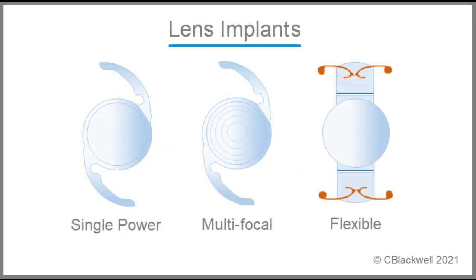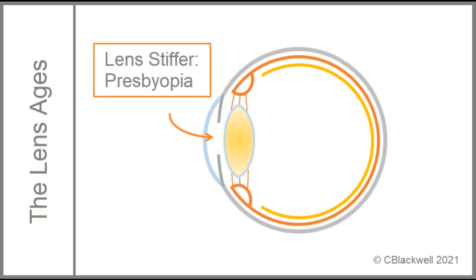While lens implants are not perfect, the results are pretty good and continually improving. They have reached the point where lens replacement surgery is becoming an option for treatment of presbyopia. It is the same as with cataract surgery, except that you're not replacing a cloudy lens. Rather, the purpose of this surgery is to regain the ability to see up close without compromising distance vision.